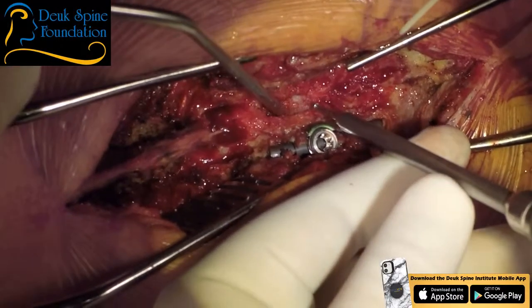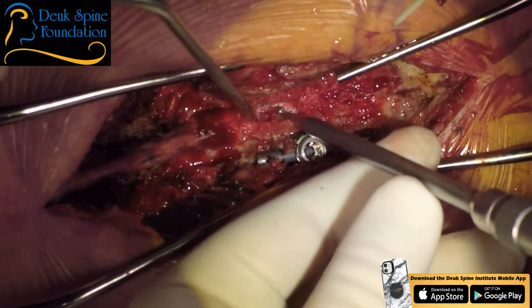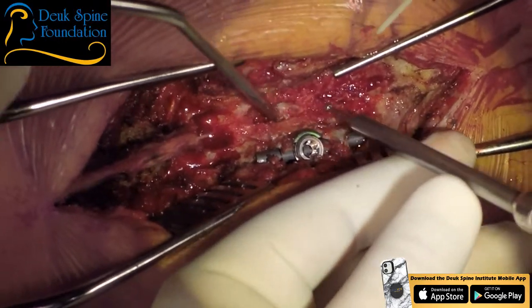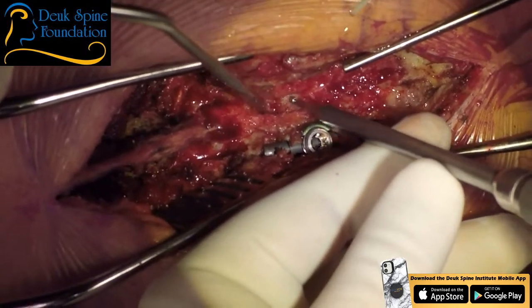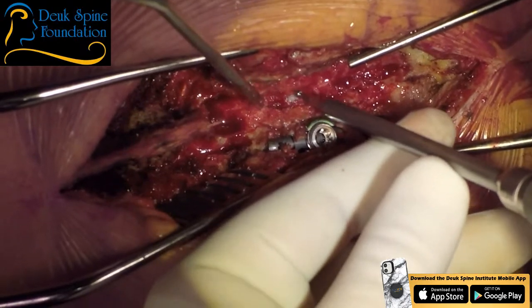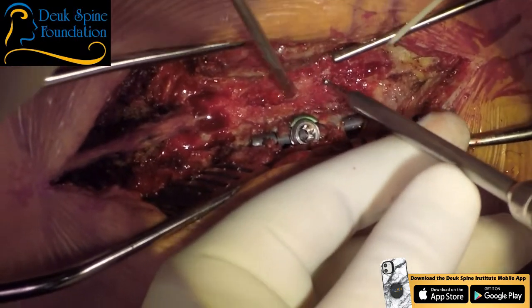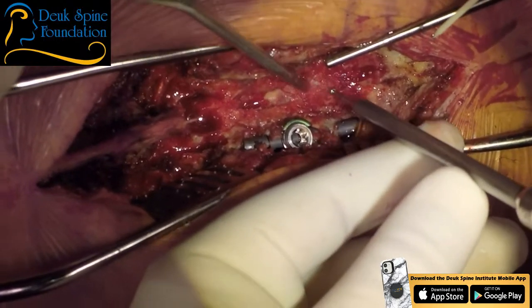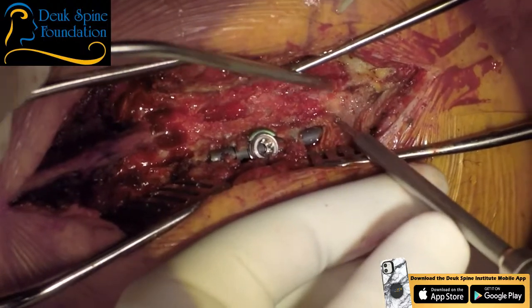Suck here. This is gonna be the bottom of the lamina. Yeah, as a surgeon, if you wanna do a good job, you gotta know the anatomy. Otherwise, you get into trouble right quick. And there's a lot of spine surgeons who don't understand the anatomy. I'm telling you, it's shameful. You'd never suspect it. Suck.